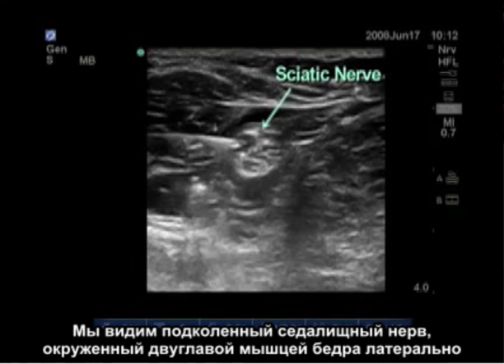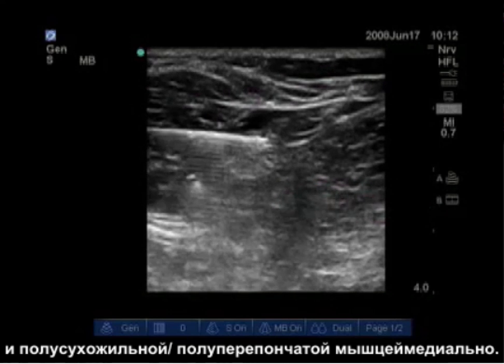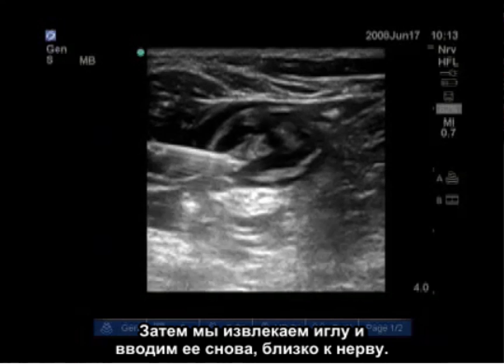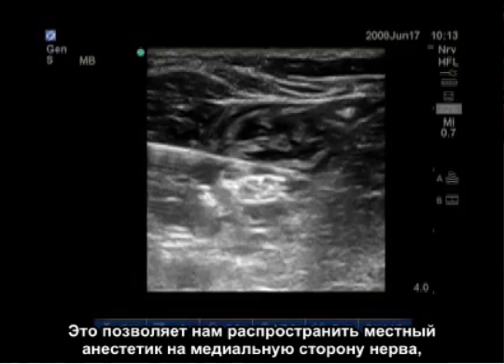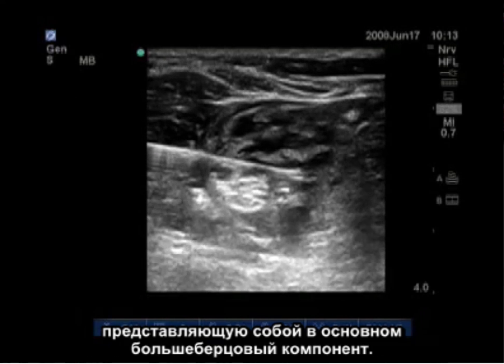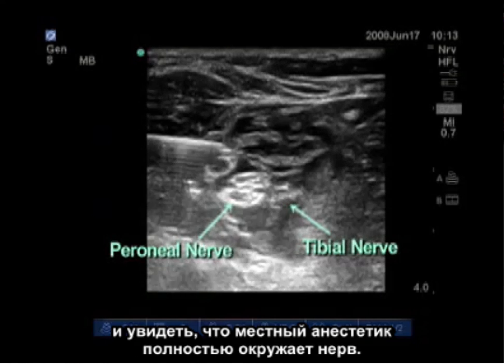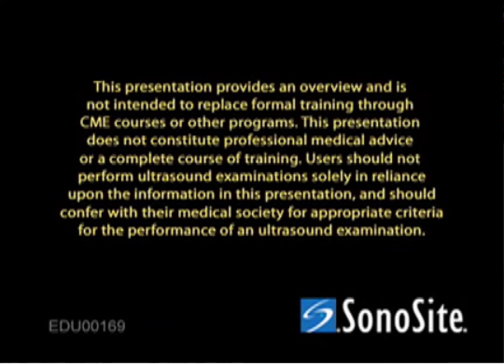Here we see the popliteal sciatic nerve surrounded by the biceps femoris laterally and the semitendinosus and semimembranosus medially. Our needle is advanced directly above the nerve and the local anesthetic is injected, pushing the nerve deeper. We then withdraw the needle and re-advance it close to the nerve so we can get local anesthetic spreading to the medial side of the nerve, which is more of the tibial component. Now you can visualize both the peroneal and tibial components with local anesthetic completely surrounding the nerves.